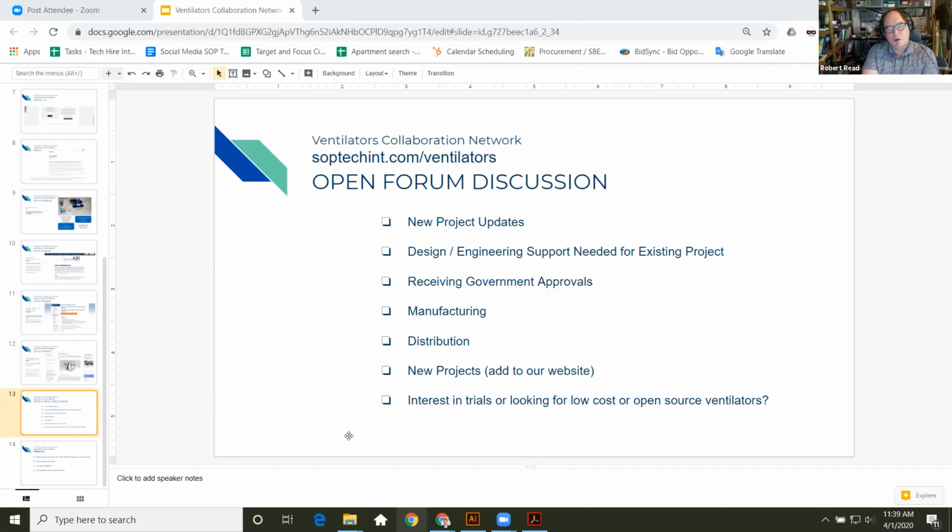And so, that's why I think an open source design that allows components to be swapped out if necessary, if only because of supply chain operation, and sufficient testing that you can be aware that a slightly different motor is not going to change the performance of the machine, is the right way to solve that problem.